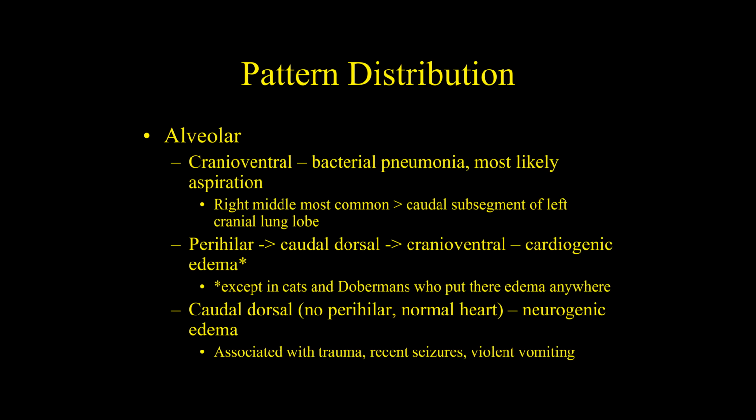Okay, so now we defined what an alveolar pattern is. An alveolar pattern is the presence of air bronchograms or complete whiteout of lung. Then we have to define where it is. Well, we started touching base on that just a second ago.